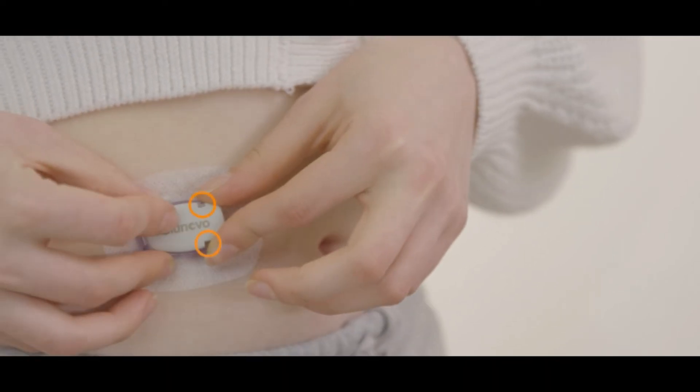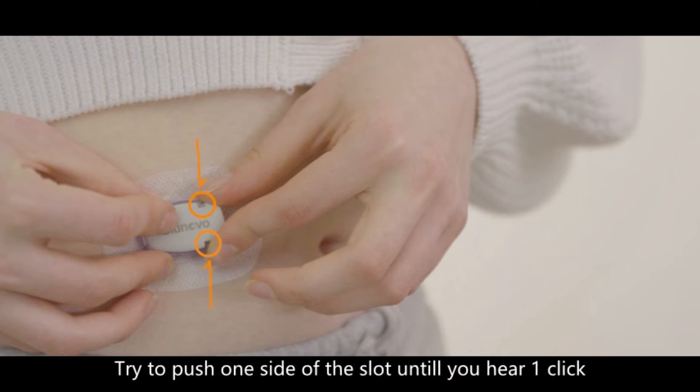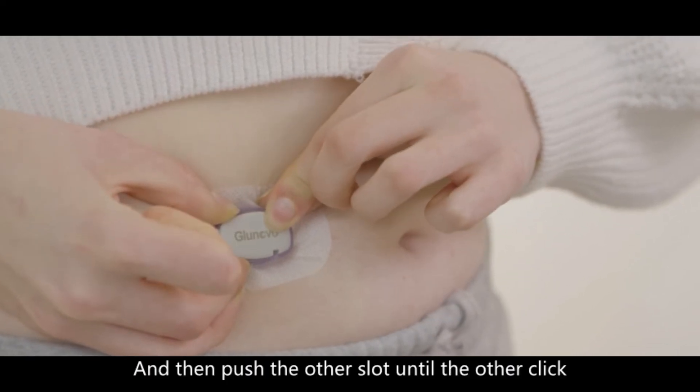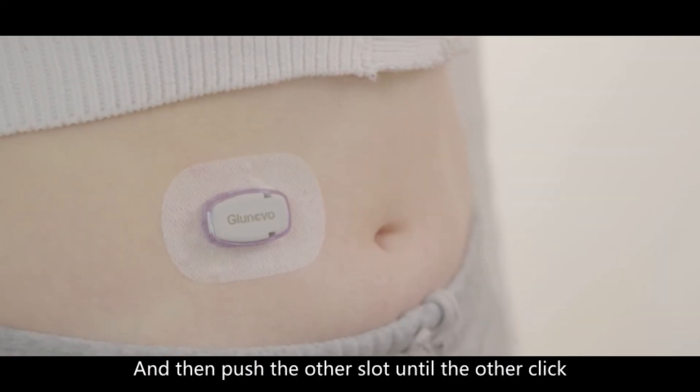Put the pointy side of the transmitter into the sensor base, then press down the other end. Try to push one side of the slot until you hear one click, and then push the other slot until you hear the other click.